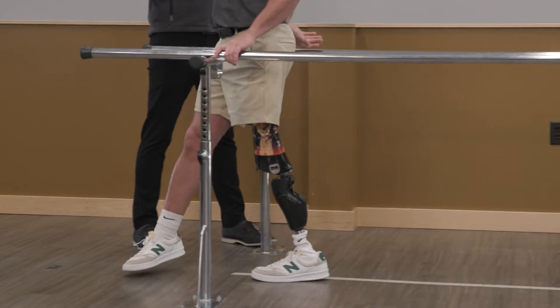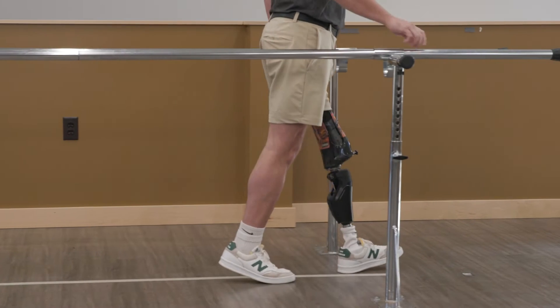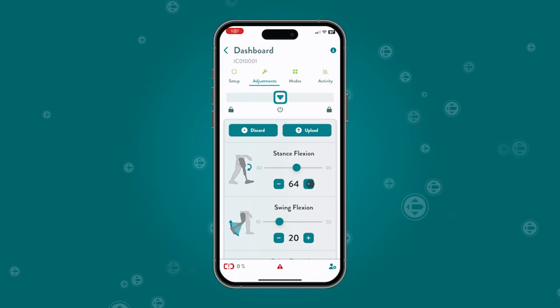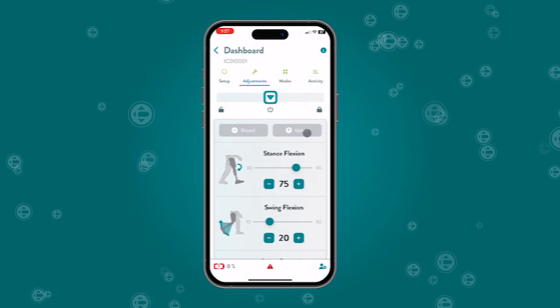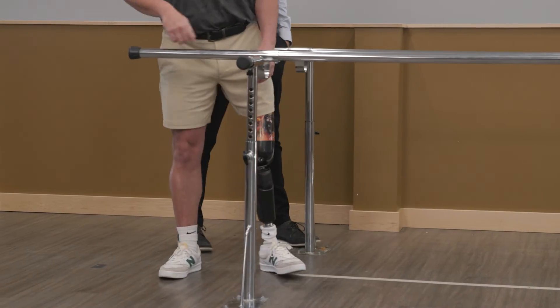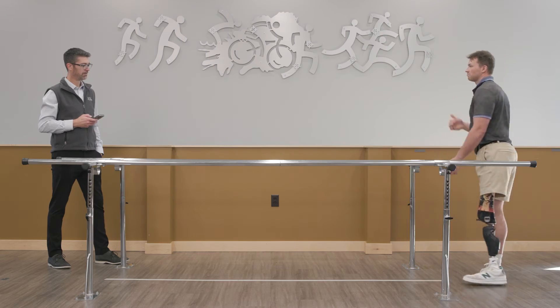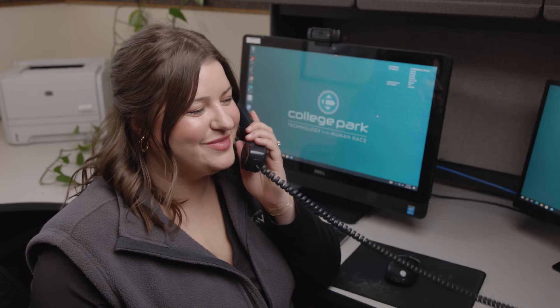The Icon knee is designed to be simple to set up — there's no calibration, so patients simply start walking and the prosthetist can optimize gait through the app settings. Make adjustments with the Stride Studio app, available for iOS and Android. Easy to use and simple to understand, the Stride Studio app makes adjustments and custom mode programming a breeze. College Park's United States-based support team is always a phone call away for any questions from prosthetists.